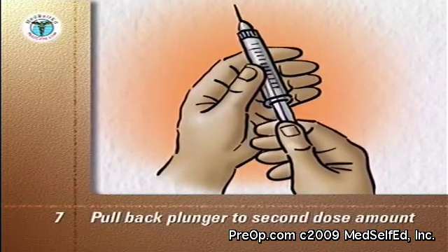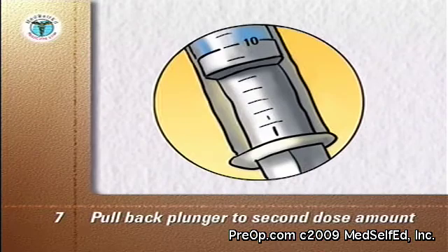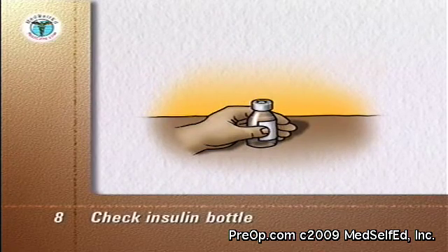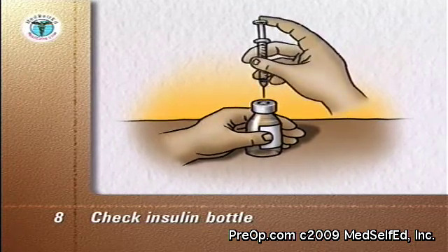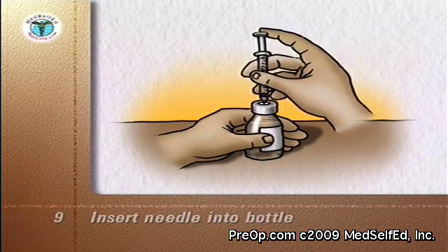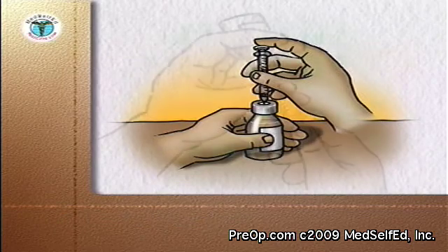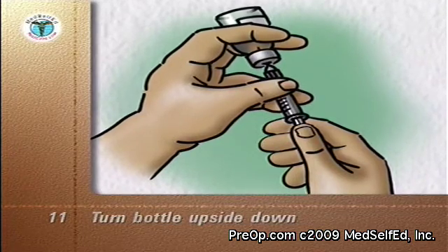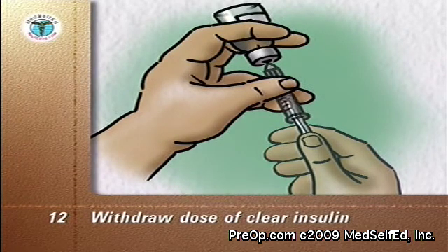Pull back the plunger of the syringe to the dose of the shorter-acting clear insulin — in this example, 10 units. You now have 10 units of air in the syringe. Check the insulin bottle to ensure you have the correct clear type of insulin. With the insulin bottle held firmly on a counter or tabletop, insert the needle through the rubber cap into the bottle. Push the plunger down so that the air goes from the syringe into the bottle. Turn the bottle upside down so that the air in it goes to the top. With the tip of the needle kept in the liquid, withdraw the dose of clear insulin — in this example, 10 units. Remove the needle and syringe.